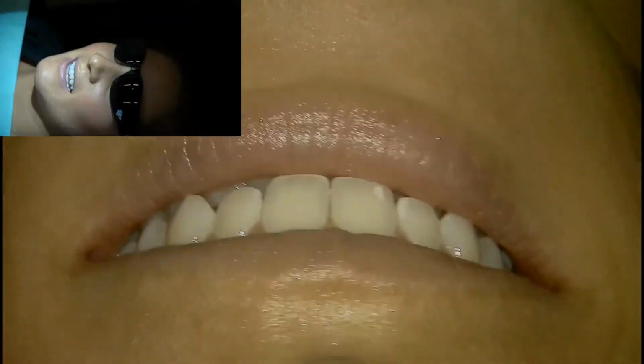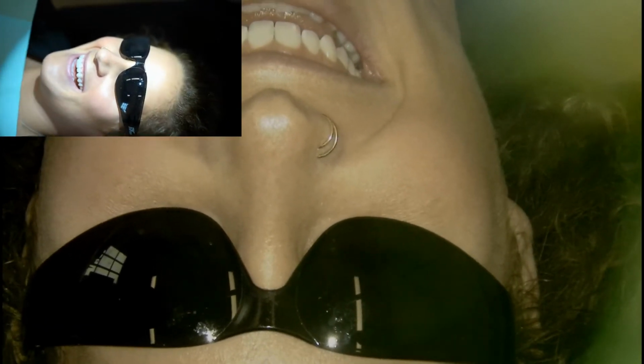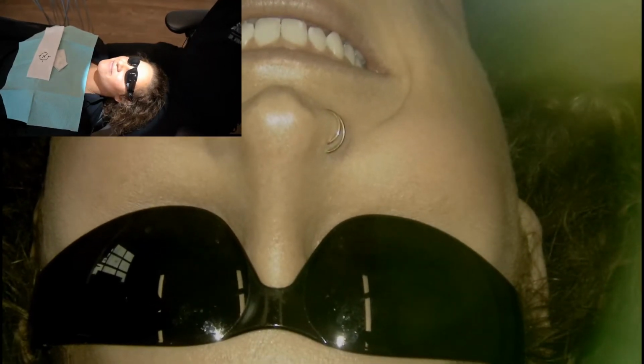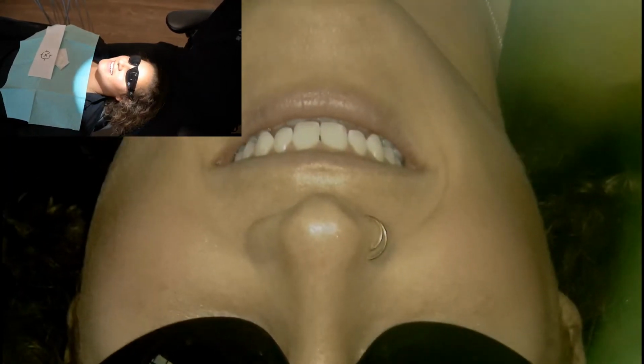But if I come back up now with dark glasses on, see how cool she looks? And then I can get her in focus here. Now, maybe you're too young, but did you ever see Happy Days? Do the Fonzie, like, hey. That dates me, but I was a little kid when that was out. All right, so then it's better for her eyes. Now you can see her eyes through those glasses. She can see. It's not that bright.